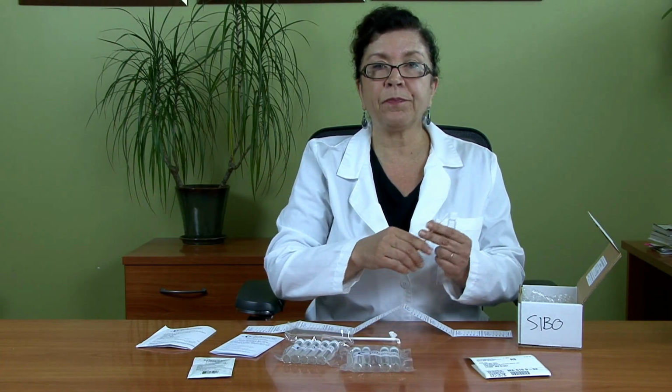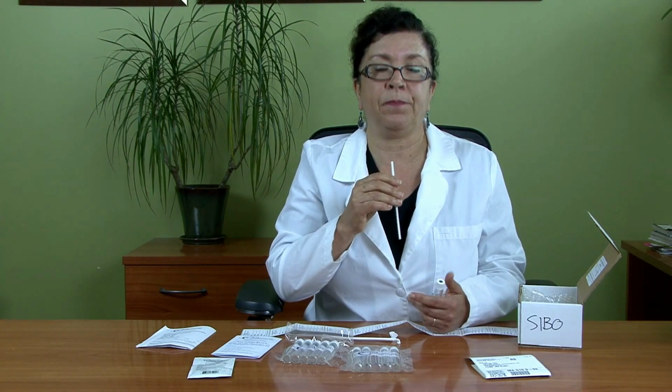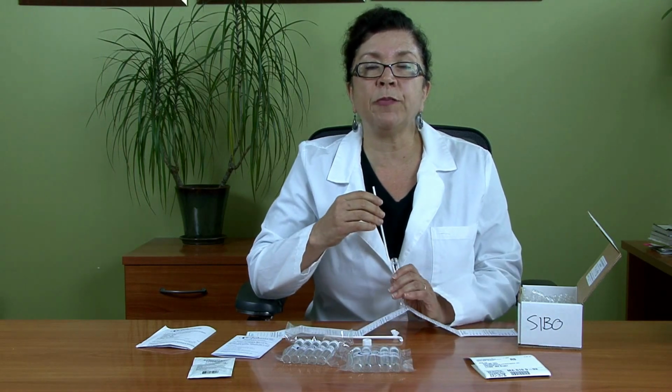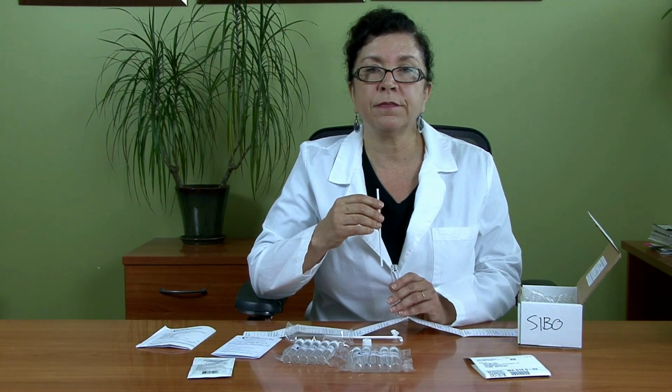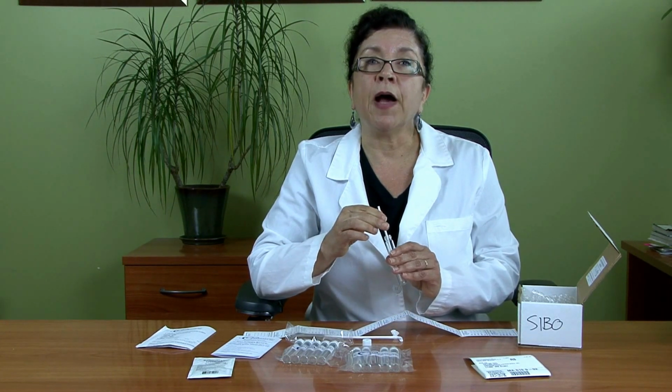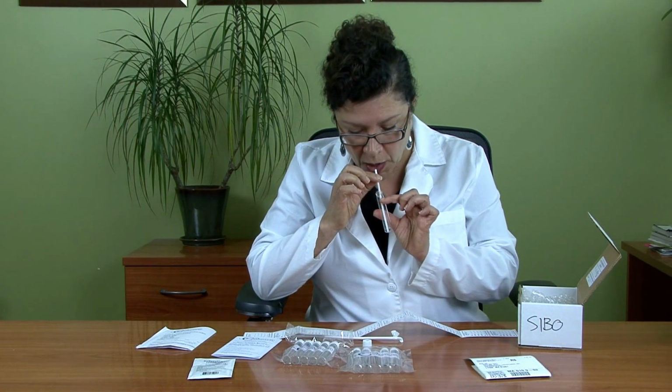Get it ready. Now, it's very important to understand that you're not going to be taking a deep breath in and blowing it out rapidly. You're going to be using normal breaths. So you just normally inhale like you typically do. Put the straw in your mouth and exhale normally. So let me go ahead and demonstrate this. So uncap. I'm going to take a normal breath in. So I'm just going to inhale. I'm putting the straw inside the tube and I'm going to exhale normally.